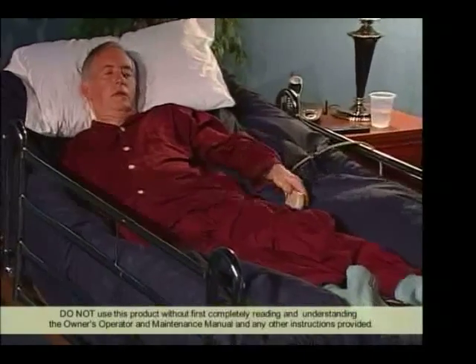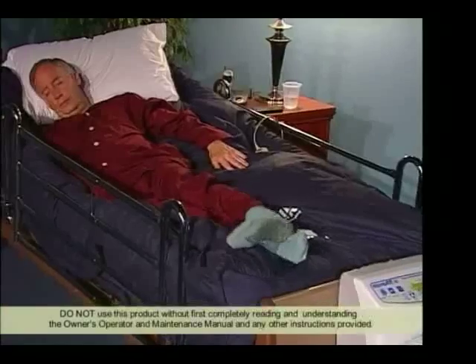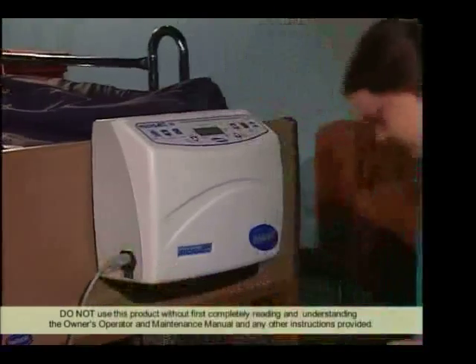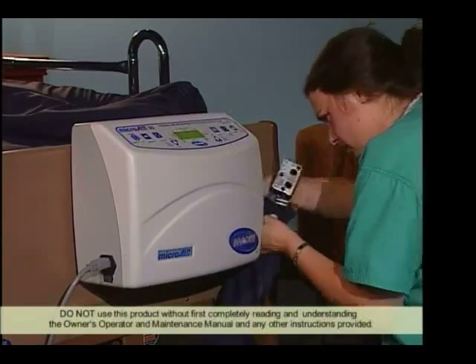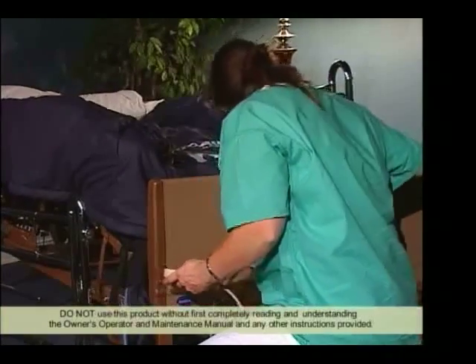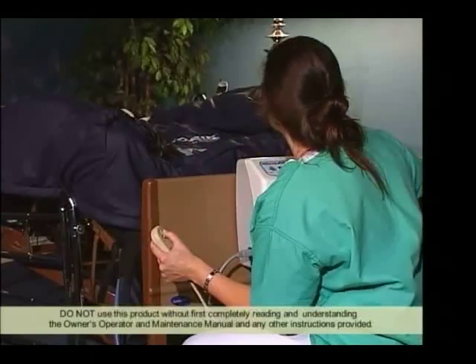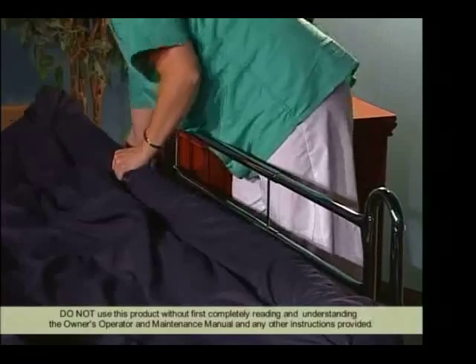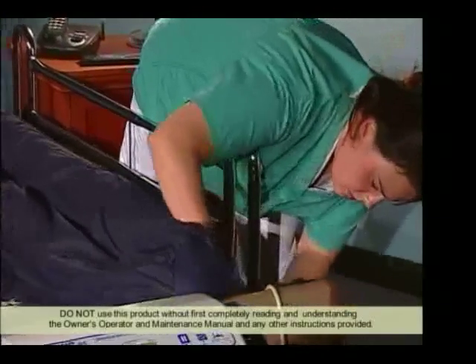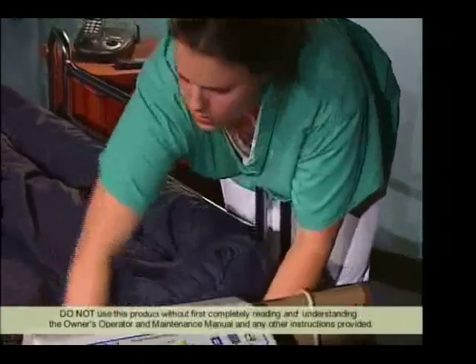All Micro-Air mattresses must be installed on medical bed frames with side rails. The side rails must be in the raised position whenever a patient is on the bed. Controls on the footboard may be obstructed by the power unit on a few bed frames, and it may be necessary to relocate the power unit. Operate all bed frame motorized functions through their full range of motion to be certain there is no pulling, interference, or pinching. Check that air hoses and power cord are clear of moving bed components before placing a patient on the bed. The mattress must fit the bed frame and side rails snugly to prevent patient entrapment. Patient entrapment with bed side rails may cause injury or death. Variations in bed rail dimensions and mattress thickness, size, or density could increase the risk of entrapment.